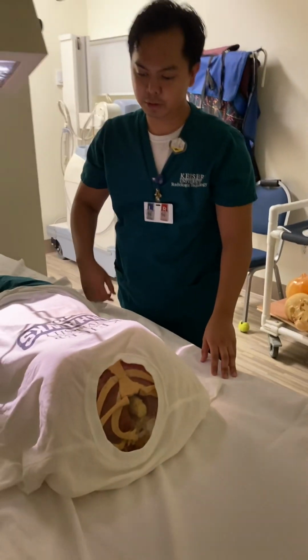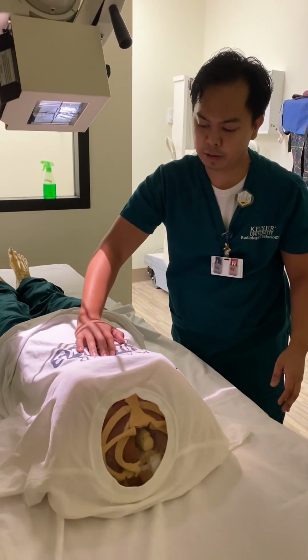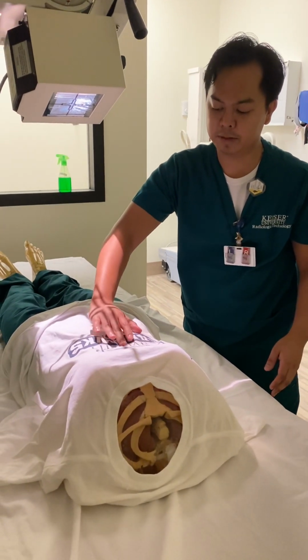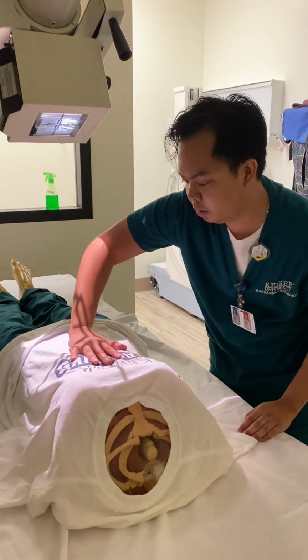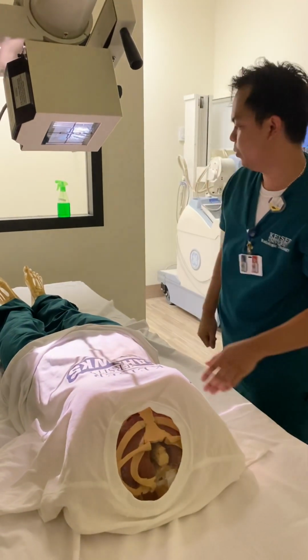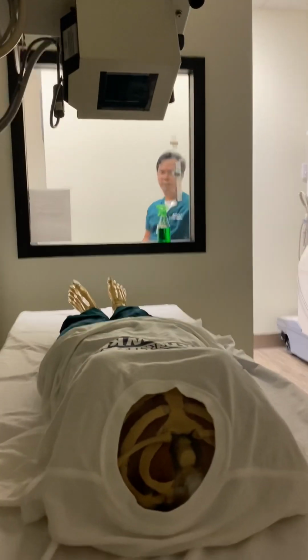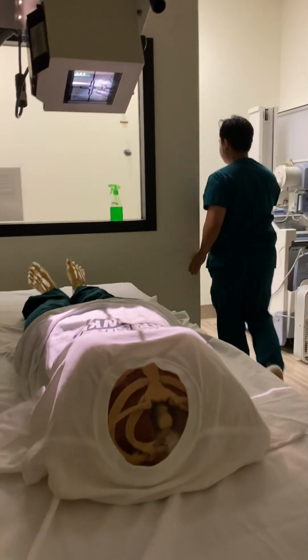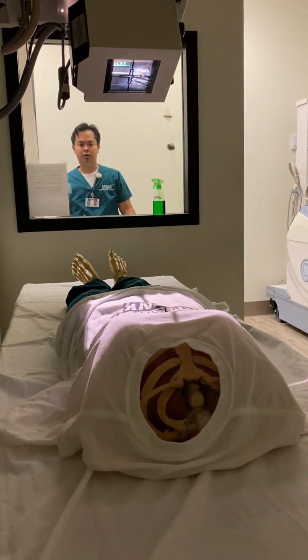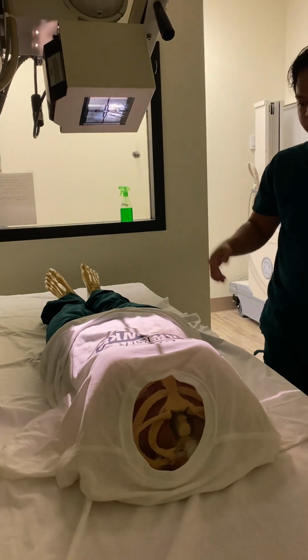So right now I'm gonna start centering our patient. To see the midline, you'll feel their xiphoid process here. So you make sure you're centered. It looks pretty centered, but you can also check behind the glass here, so you can see what it'll look like. Put the light on again. So it looks pretty centered. So you don't need to move the table left and right at all.